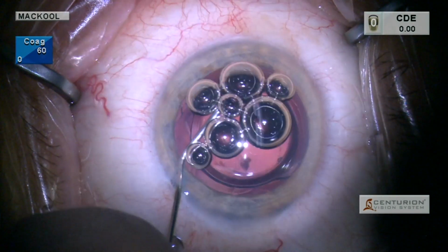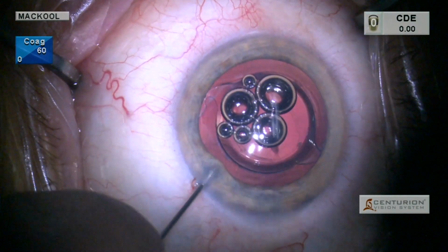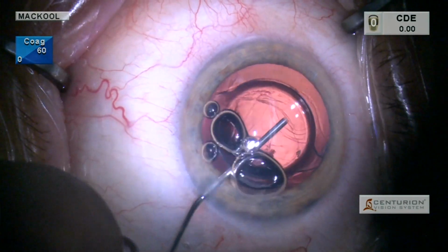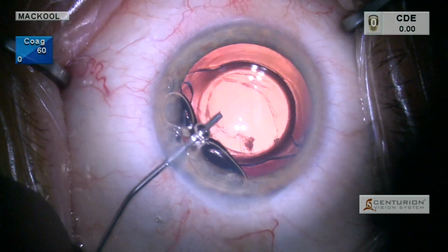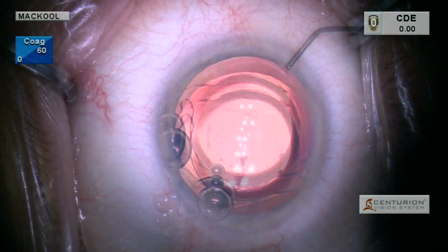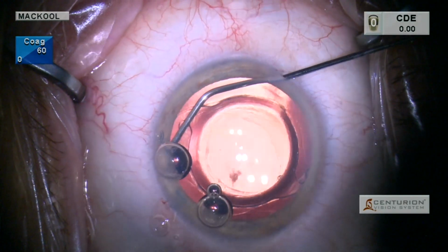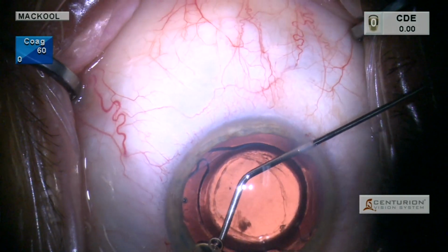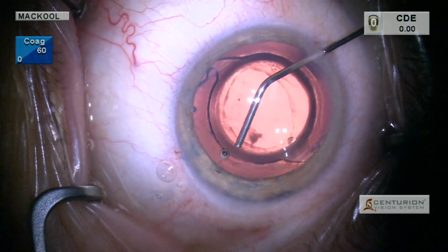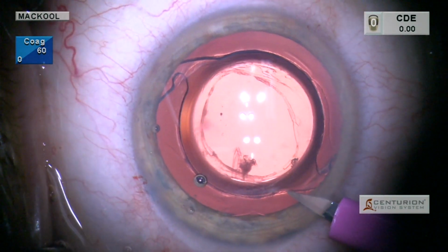So I'm now irrigating the trypan out of the eye and aspirating these bubbles. And now I'm going to inject OVD distal to the remaining bubbles. The staining of the anterior capsule here is mild. Maybe it'll help us to visualize the anterior capsule, however, during the prolapse procedure. So just aspirating now these bubbles so that we get the best view, and now I'm going to make a little side port incision over here.